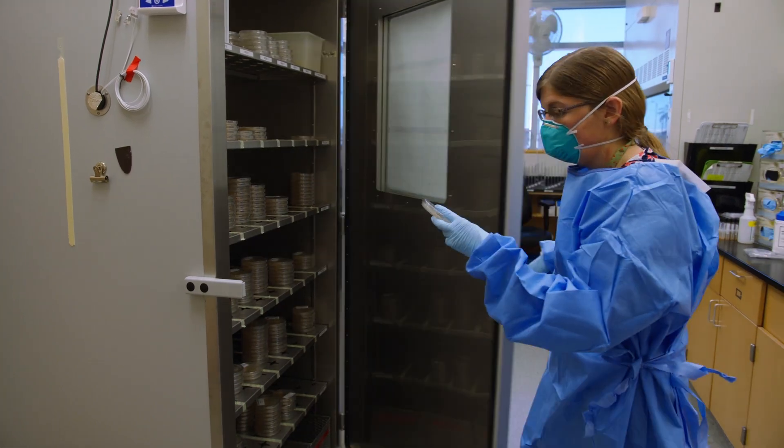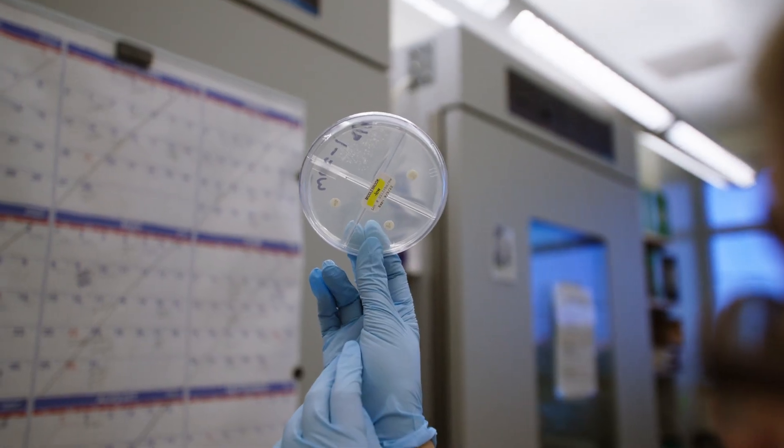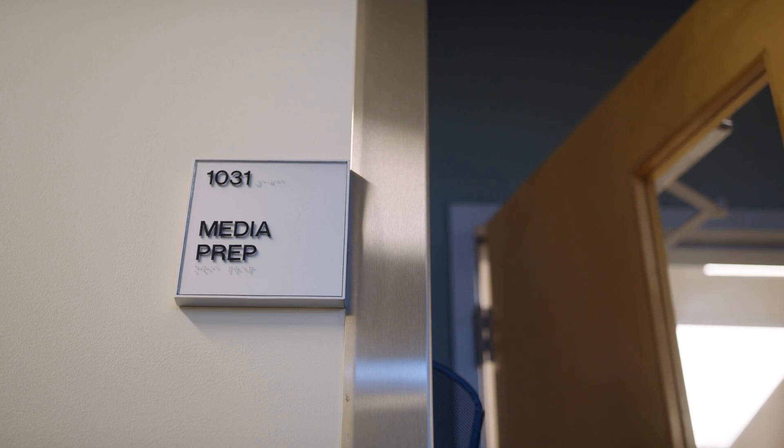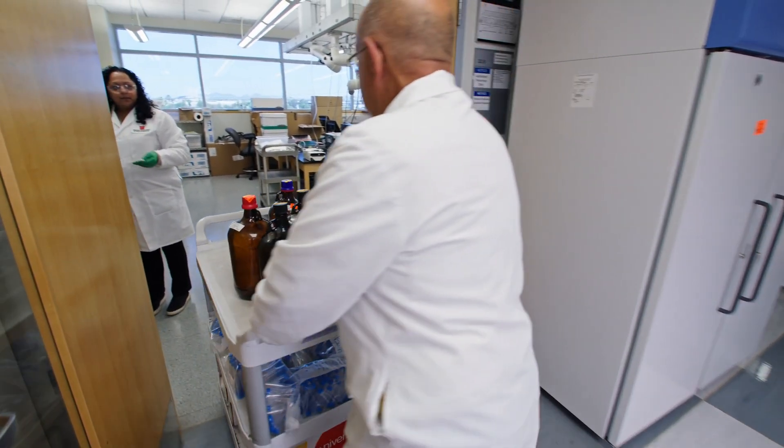A sample that tests positive will be placed in each section of an unusual four-quadrant plate. These plates are made in the media prep room just downstairs to insulate the tuberculosis program from supply chain disruptions.